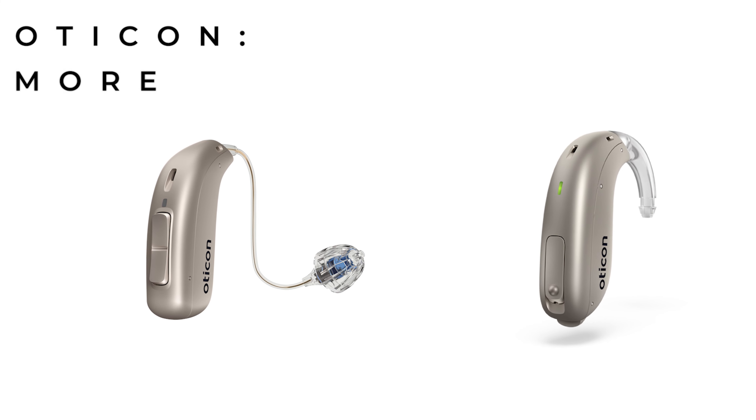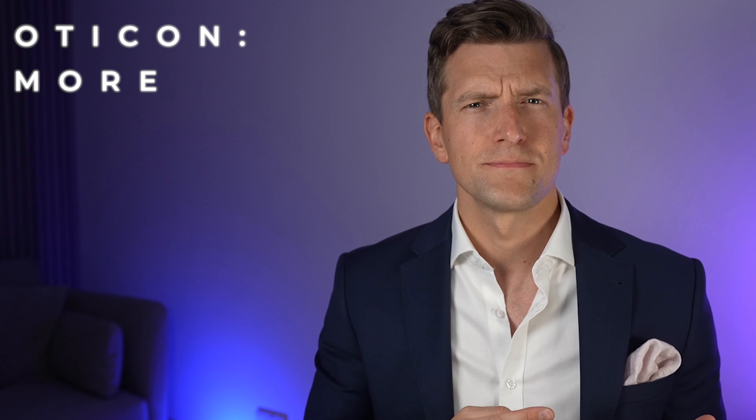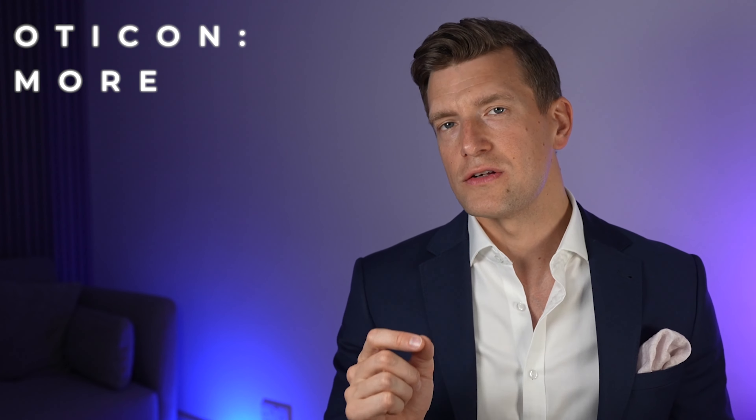Oticon's latest range, the More range, have two different form factors of rechargeable hearing aids — both the More Mini-RIE and the More Mini-BTE. On a side note, if anybody out there knows why Oticon put 'Mini' in the model of all their hearing aids, which are clearly all getting bigger, let me know in the comments. Both of these styles are available in three different technology levels: the More 1, More 2, and More 3. The lower the number, the more advanced the hearing aid.